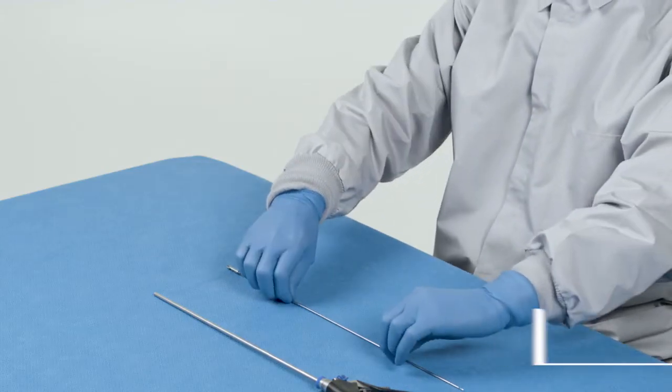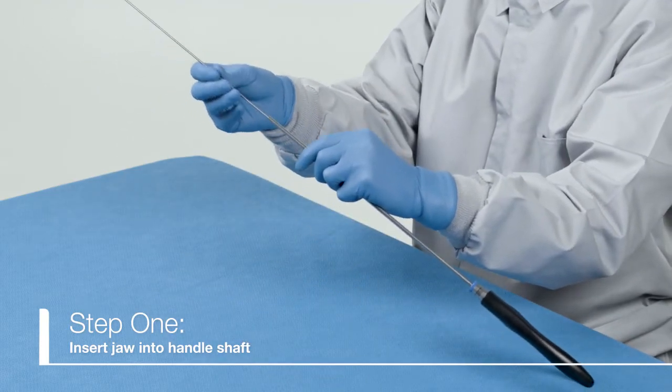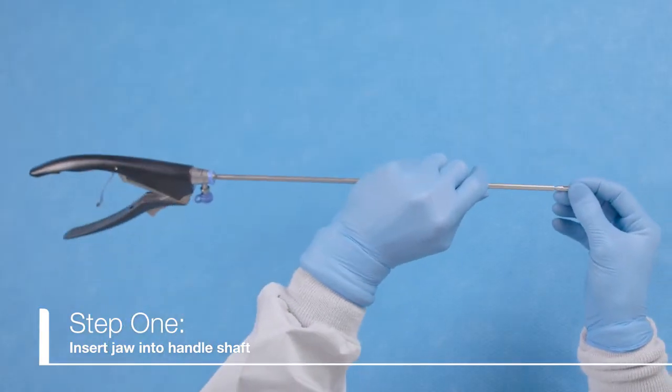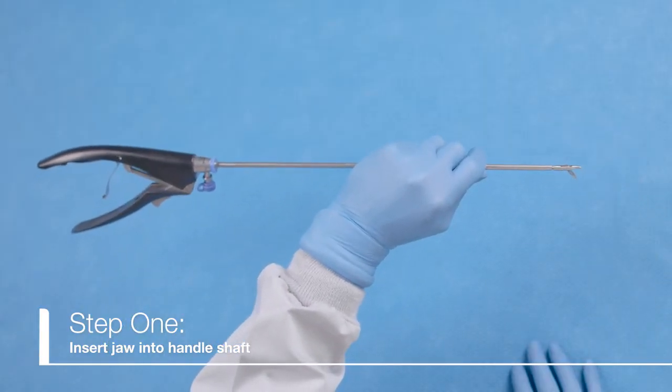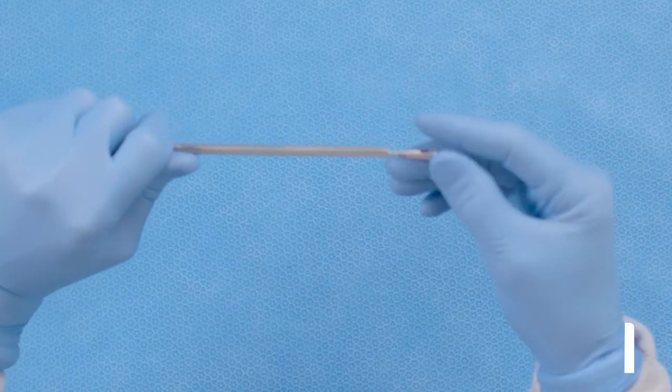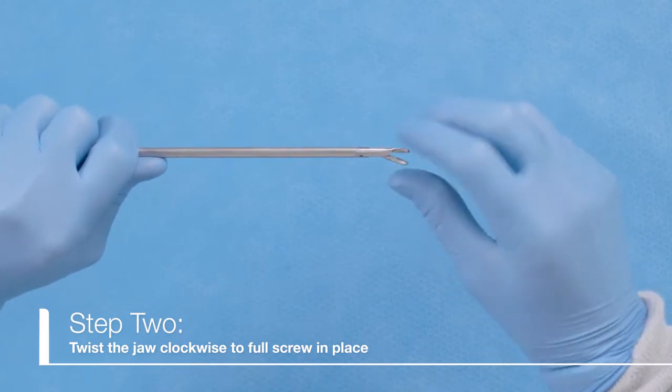The first step in the assembly process is to place the jaw insert into the shaft of the handle. Push the insert fully into the shaft until the bottom lever of the handle deflects upwards. Twist the jaw clockwise until it is fully screwed into the shaft.